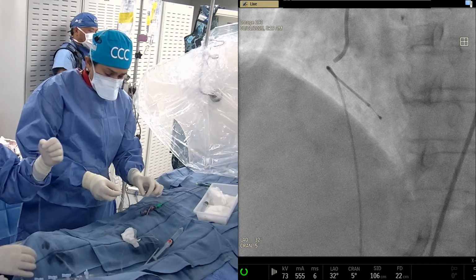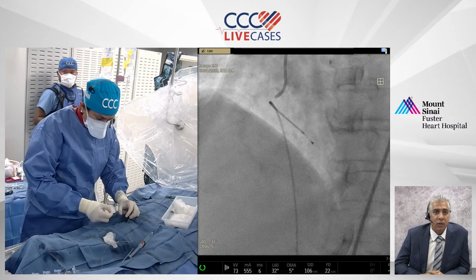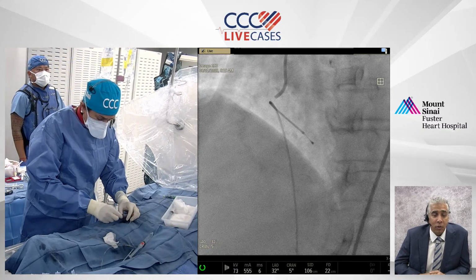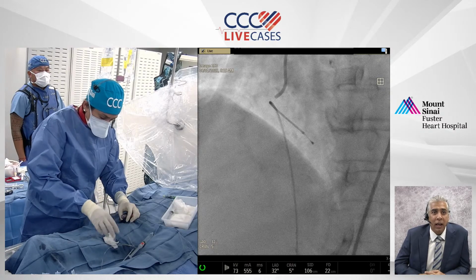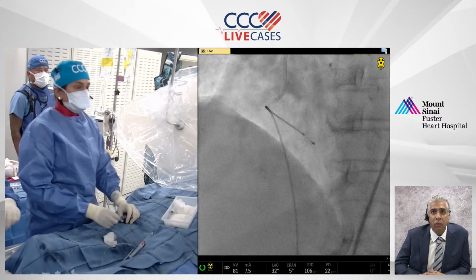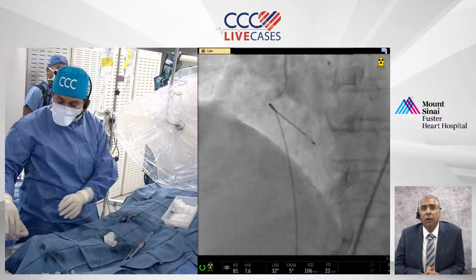No, finish, yeah. I was just going to say, obviously one of the limitations is patients with advanced kidney disease, and understanding a modified way to do it is important. But I think in cases where you can use the dye, it's probably best for image quality. That was from Mayank Yadav. Thank you for that. Okay, some dye.